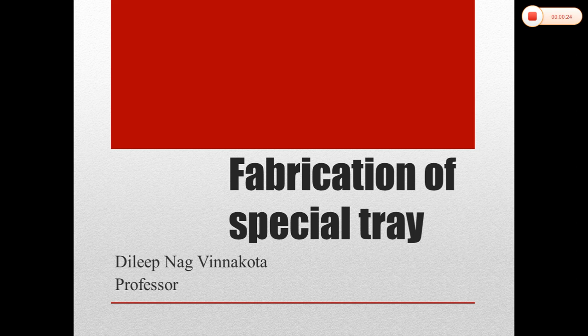As we all know, when we classify the types of trays that are used for making impressions, we can always classify them into stock trays and custom trays.